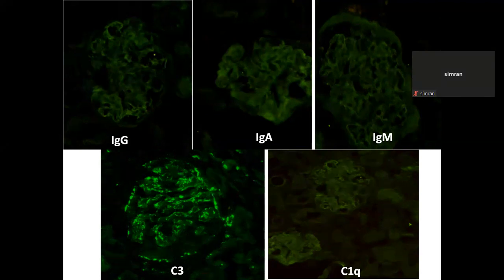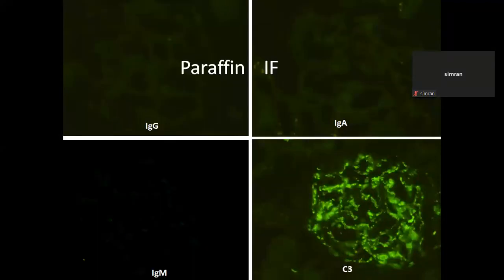Okay. So I did paraffin immunofluorescence also in this case. Can somebody tell me what was the reason why I did paraffin immunofluorescence in this case?